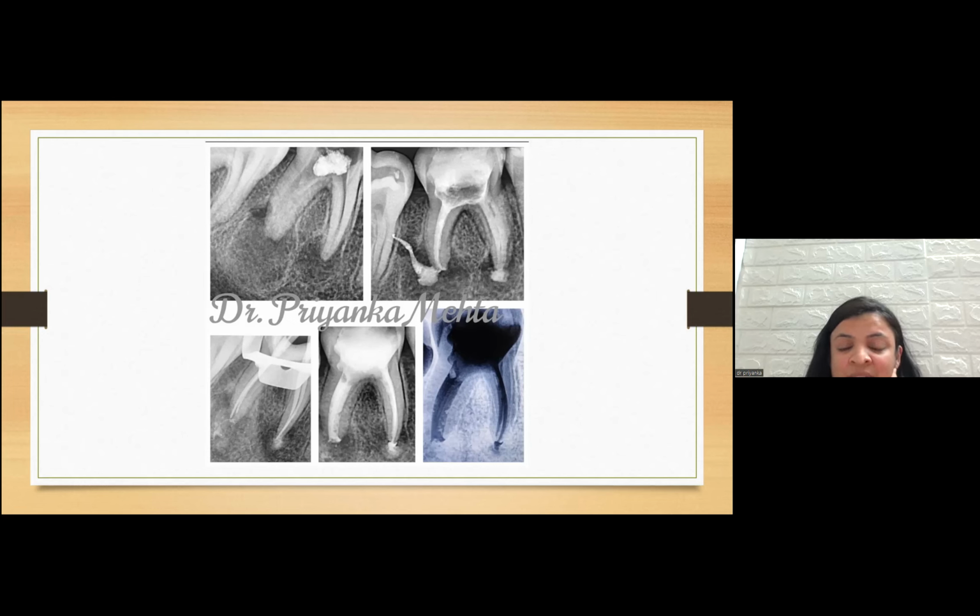But this was a 10-year-old kid. His exams were going on, so I did not have any option other than giving open dressing for one day. I cleaned it after 24 hours, disinfected, and again filled it up with calcium hydroxide. And after 15 days, I took the mastercone radiograph, and I filled the entire distal canal with MTA and the mesial canals with GP points and bioceramic sealer.